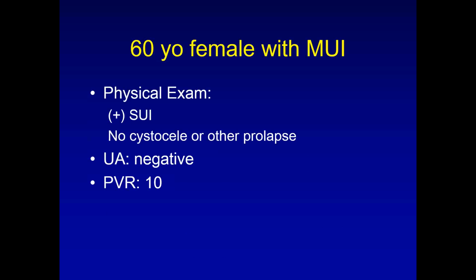So, should we just pursue the stress incontinence and go after the treatment for that? Or does the urge component spook you, and that should be addressed, or do you want to study her? Well, I have her here, so we're studying her.